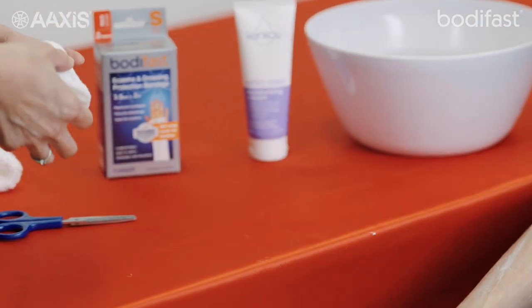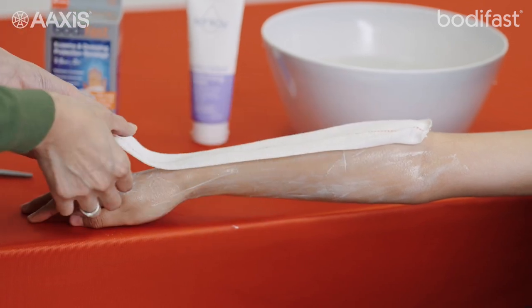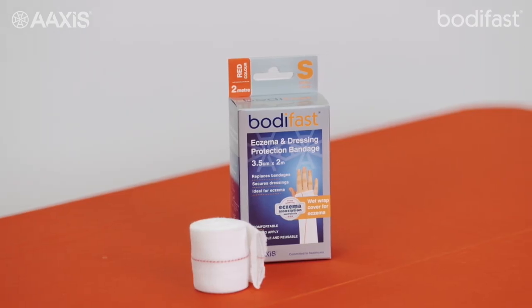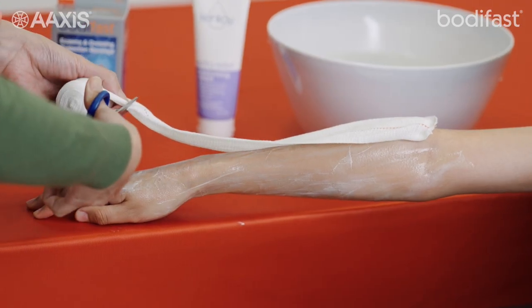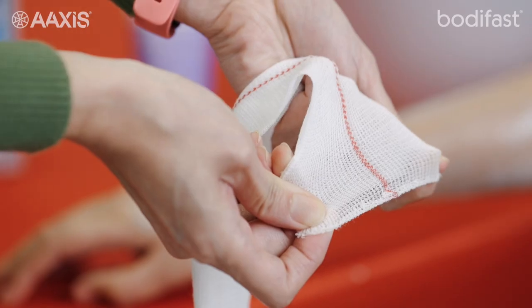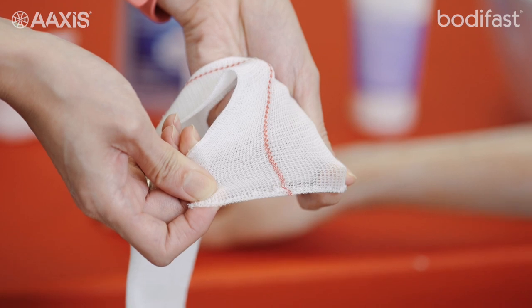Choose the right size bandage for the affected area so that it is not too tight. Bodyfast bandages come in a range of sizes that are each colour-coded to indicate the bandage size and the size of limb they are suitable for. Measure and cut two layers of Bodyfast tubular bandage to the required length. As you can see, Bodyfast bandages are very lightweight and breathable.